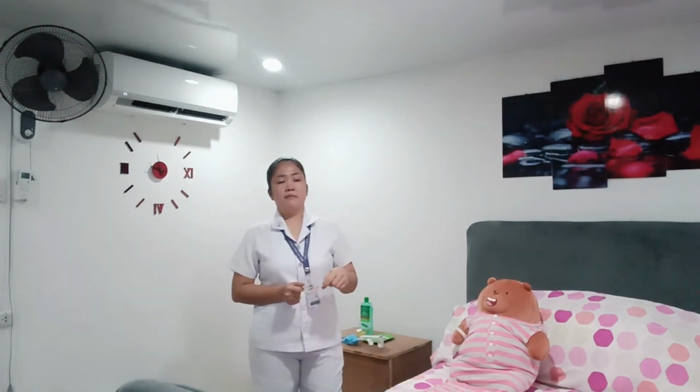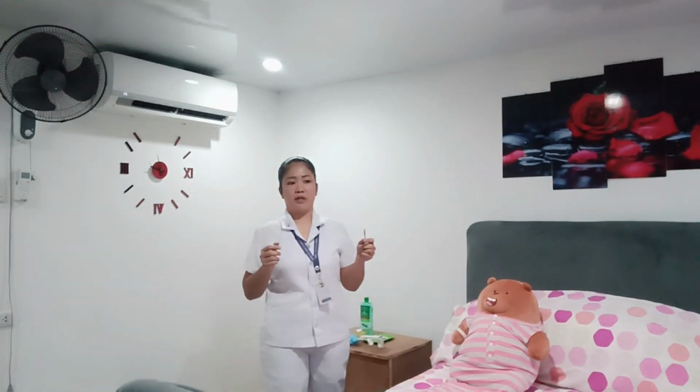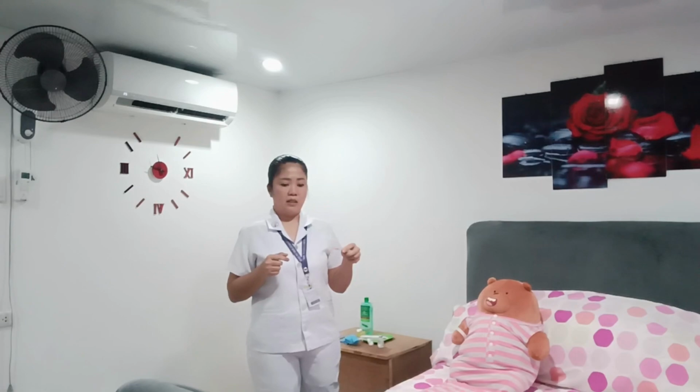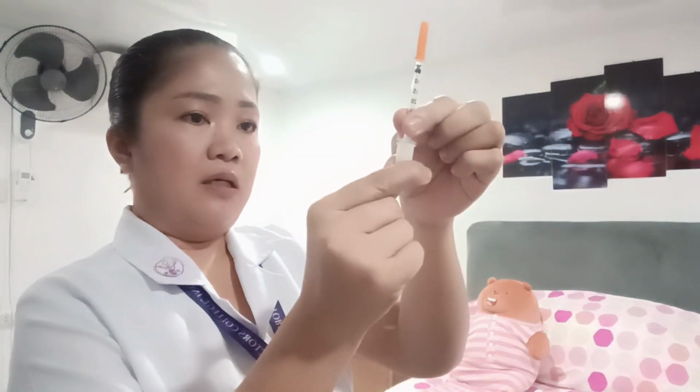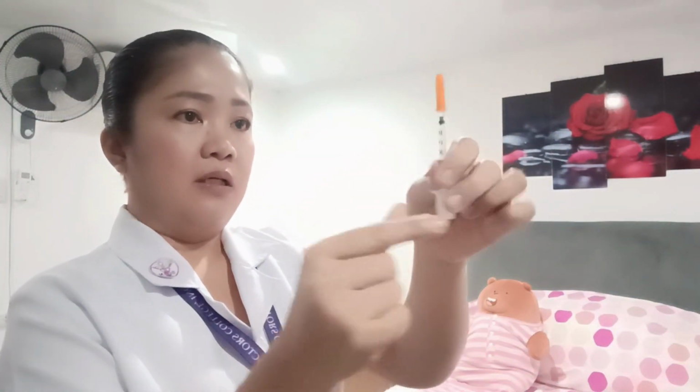Now that I am done with my subcutaneous injection, let me show you a quick video of insulin, because I have here an insulin syringe. I'll show you how to do it on the stomach or tummy area. We have a safety lock here. We have to remove that one, and also this one.